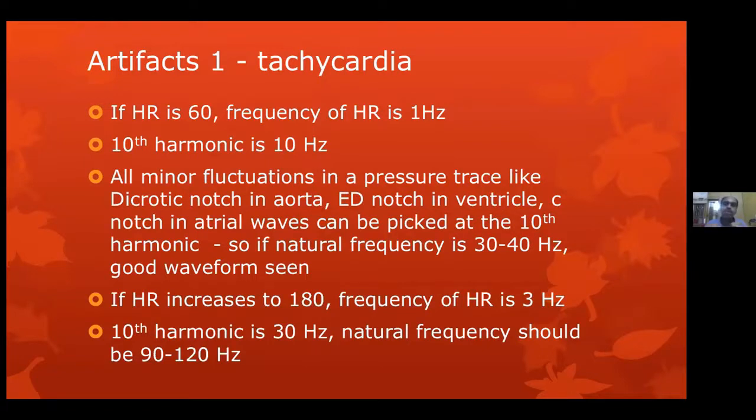In some of the machines, it will be 50 followed by 100. So what will happen? The machine will be at 0. It will go up to 50. It will go up to 100. So it's just pressing the button, see 50, 100. Suppose if it is not there, that means there is something altered in the calibration. Again, flush all your ports and then recheck it.